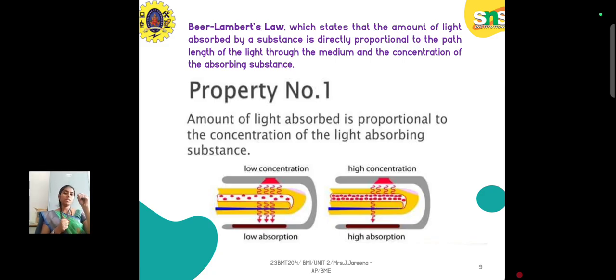It means that you are passing the light from the light source all the way through the finger. That means it passes through arterial blood and venous blood and then reaches the photodetector. The pulse oximetry component is a clip-like device, just placed over the finger. On the top of the clip you have the light source and on the bottom of the clip you have the photodetector. The light source passes the light through the finger, and based on the absorption, the remaining left out light is detected by the photodetector. So this is how the mechanism goes on.